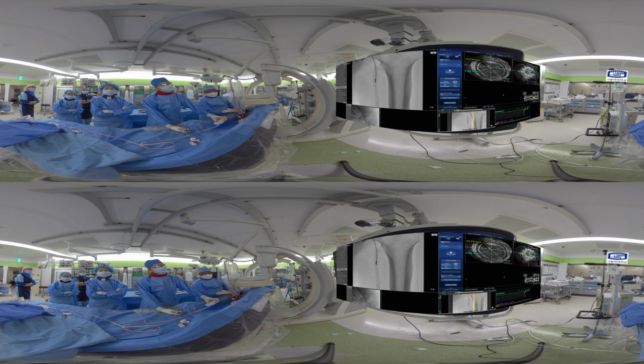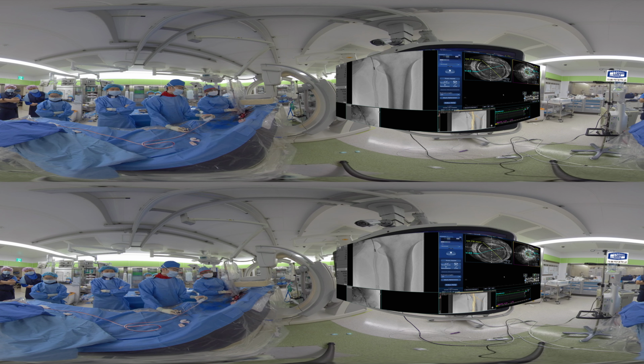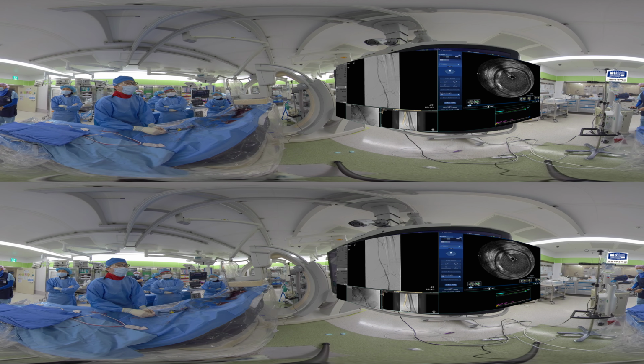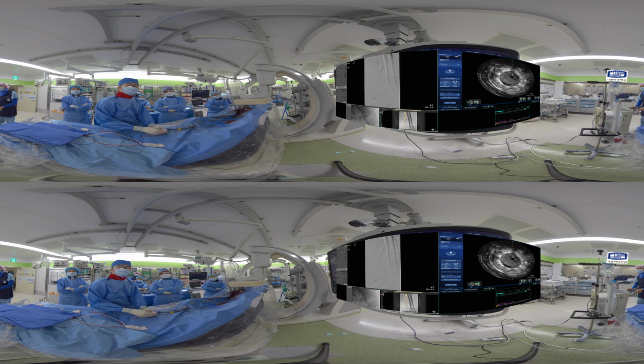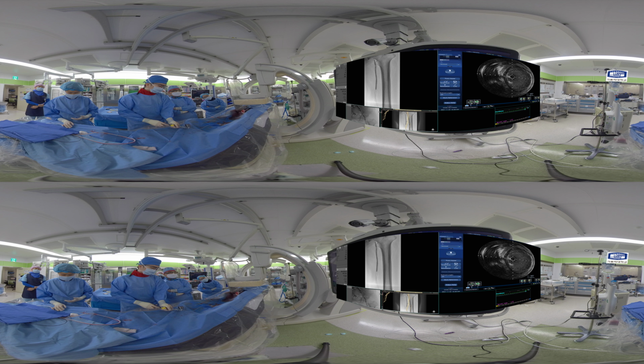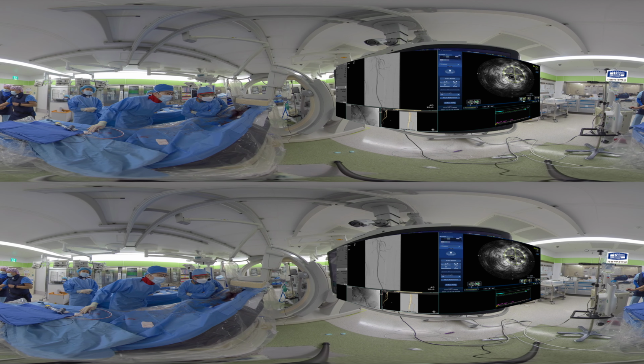The JETstream catheter was passed without blade up 4 times. And then we pulled back the catheter, and it can aspirate thrombus in the lesion. And then balloon angioplasty was done along the atherectomy site with a Sterling 5 mm, 20 cm balloon and a 5 mm, 20 cm Ranger drug-coated balloon afterward.